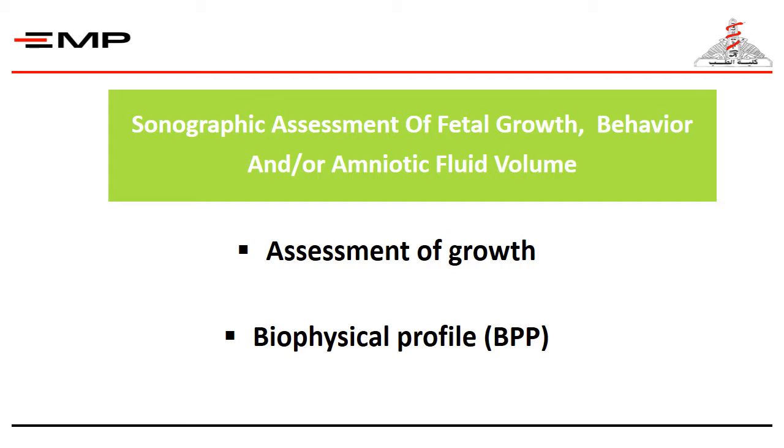Ultrasound assessment of fetal well-being includes assessment of fetal growth through biometric measures that are plotted on fetal growth charts, as well as the performance of a biophysical profile. You may have the opportunity to observe ultrasound assessment for fetal well-being during your clerkship activities today. It's becoming universal day-to-day practice in any maternity hospital.